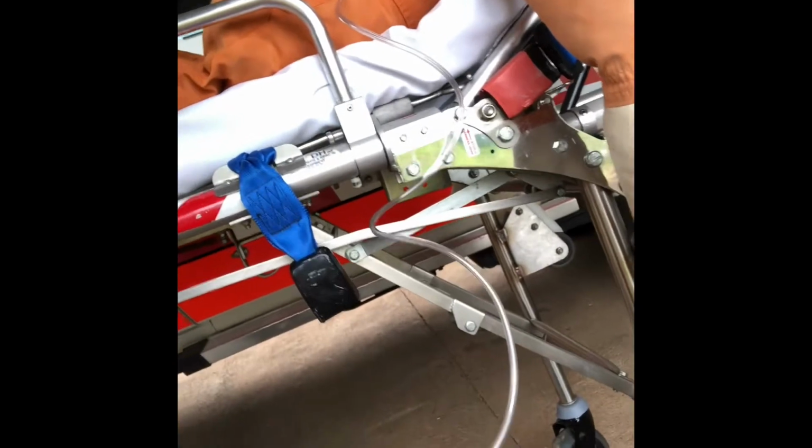We're going to ensure that the drain unit is below the patient at all times, and the tube is not laying on the floor. We're going to observe that there are no kinks in the tubing either.